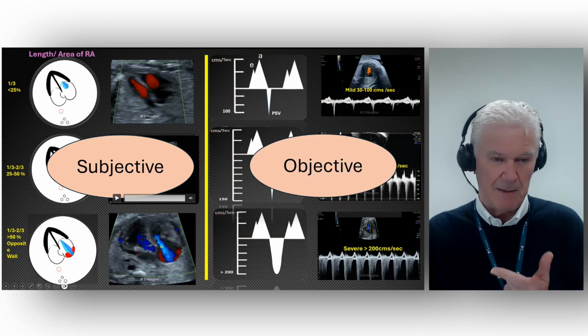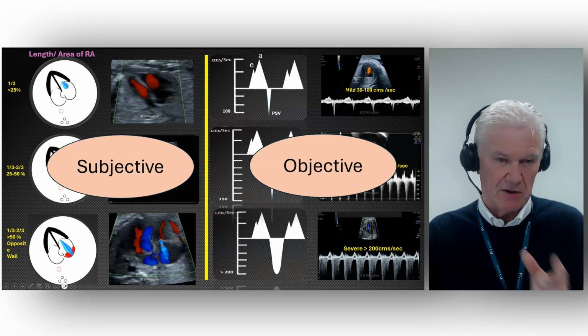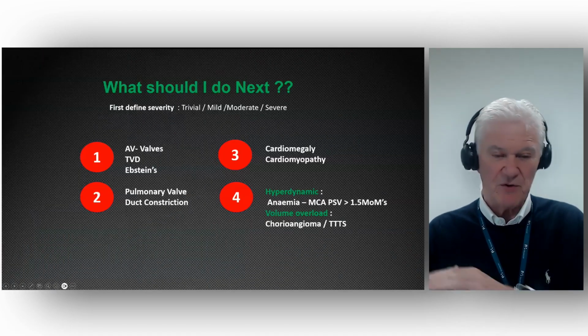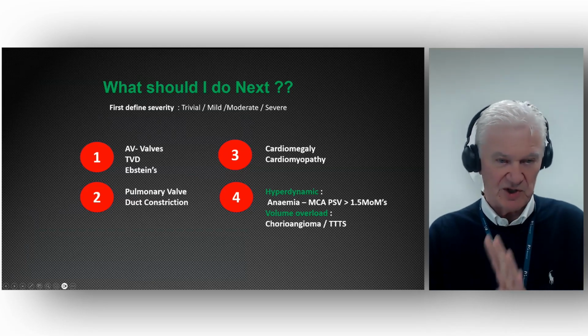And you can come back to this clip later and play these and just watch the spectral pattern compared to the color Doppler pattern. Once you've done the subjective and objective assessment, before you make any call about severity of anything, you go through 4 steps.